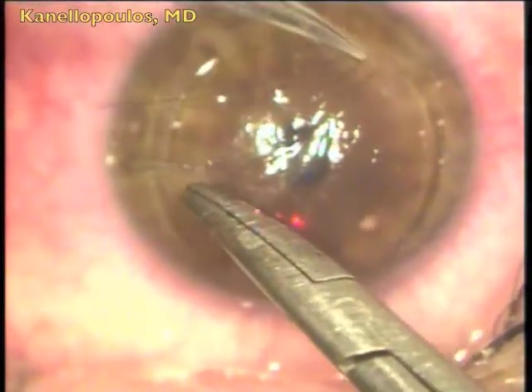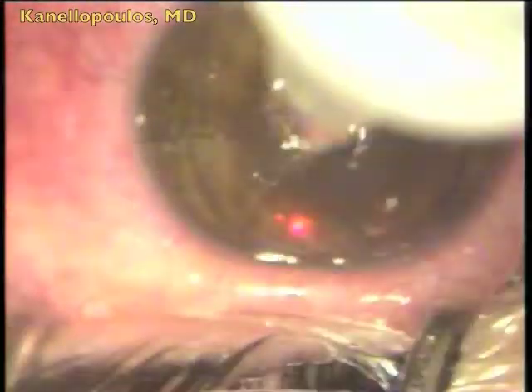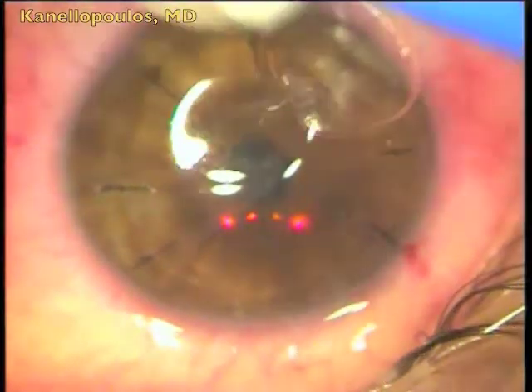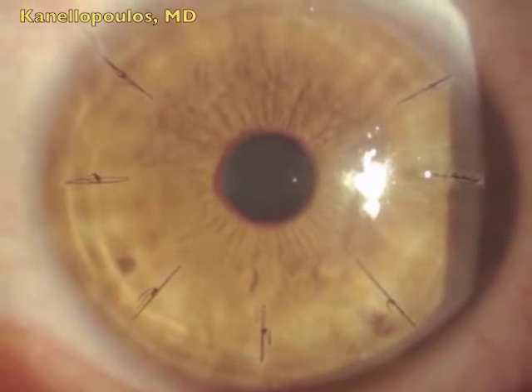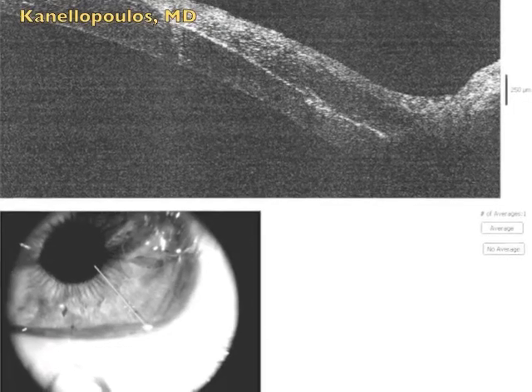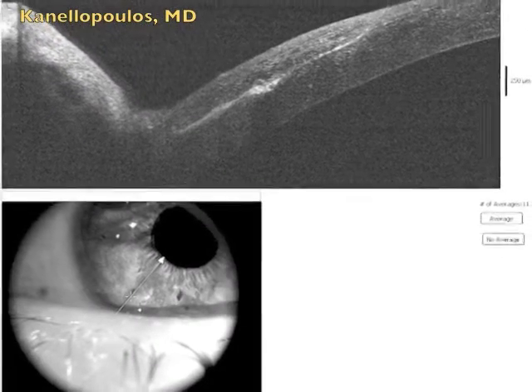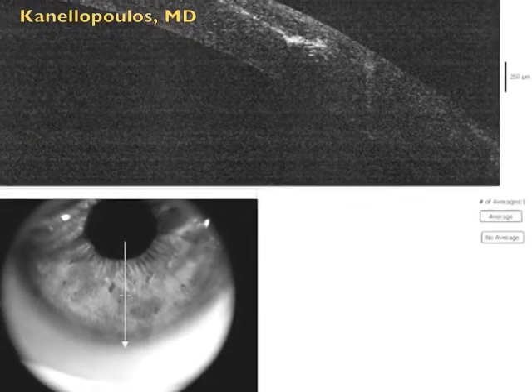As you can see, square knots with a lot of tension, bringing the knots out, trimming and burying them in the outer cornea, then applying a bandage contact lens. We see the patient the next day. After removing the lens, you can see how perfect the flap looks and how fast the surface epithelium has remodeled — it looks pristine. Vision uncorrected is already 20/40. You can see the suture track peripherally in the flap. These are OCT images showing the sutures going through the flap and the outer stroma — remarkable images from the OptiView anterior segment OCT.